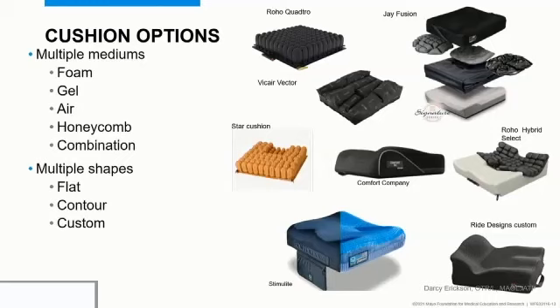So then you've got honeycomb and you've got gel, and there's benefits to those. Lightweight and very breathable. Again, pretty low maintenance, and they can be cut to shape in some instances. And some of the honeycomb have been great for filling in for skid loader seats, tractor seats. I'm from the Midwest, so we have a lot of skid loaders and tractors. Motorcycle seats, riding your horse. So there's a lot of those kind of benefits.